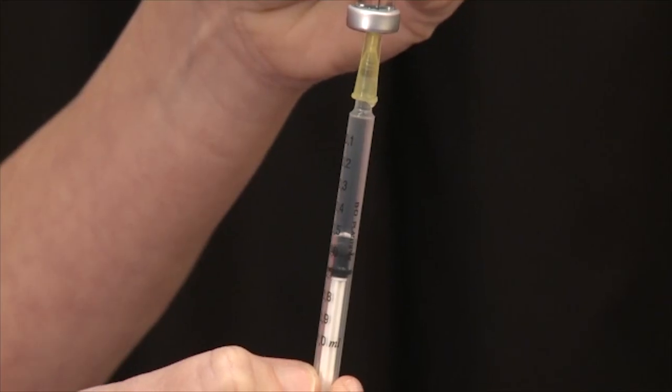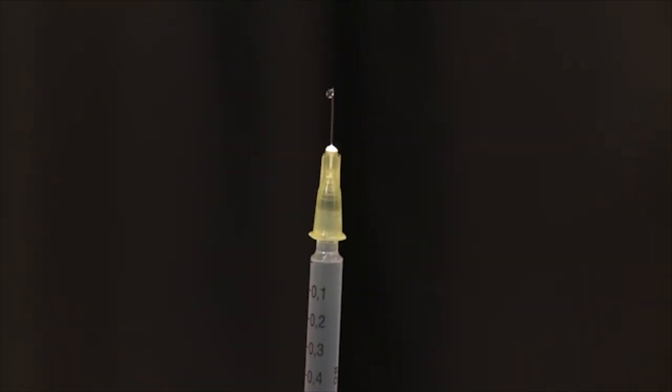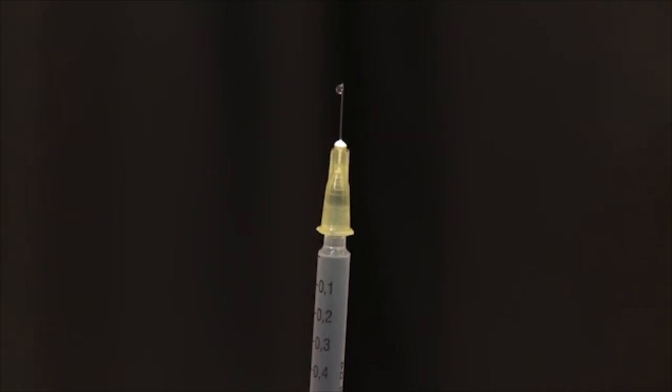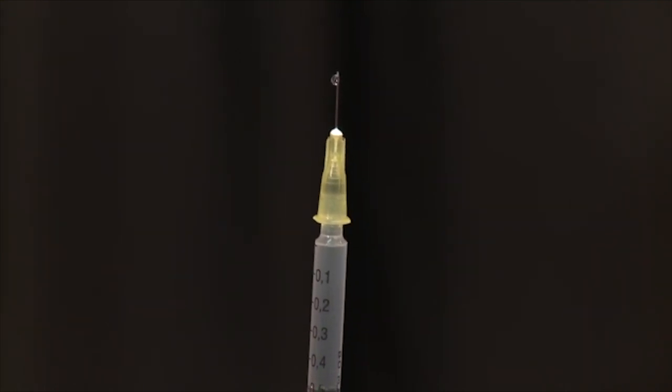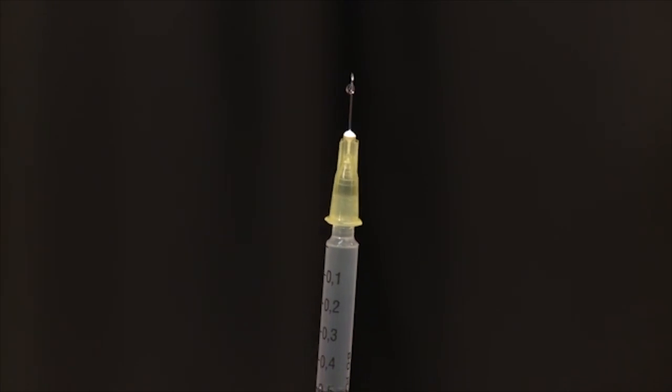In this case, we are injecting 0.5ml. There should be no air in the syringe. After ensuring there is no air in the syringe, by pointing the syringe upwards and pushing the plunger until a tiny droplet appears at the end of the needle, the injection is ready to be given.